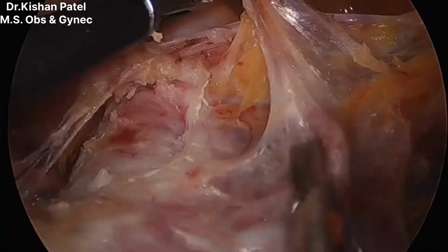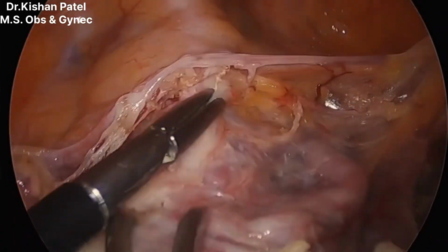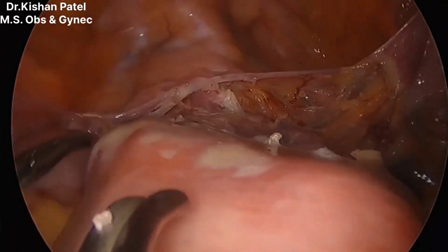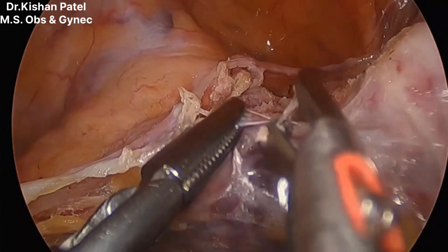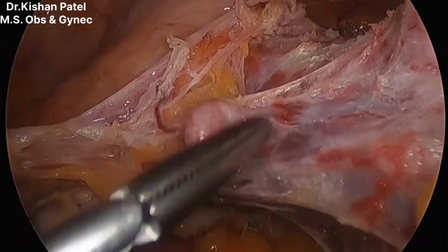We can see the beautiful right uterine artery, tortuous, as you can appreciate on the right side of the uterus. Okay, so I am skeletonizing the left uterine artery. You can see the vein also beneath the artery.